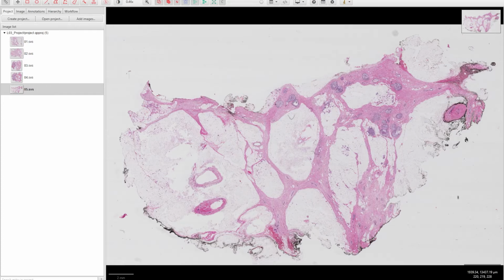This tool is essential for quantifying cell populations, assessing biomarker expression, and supporting diagnostic or research workflows, providing reproducible high-throughput analysis while allowing manual review and correction to ensure precision. So simply, the cell detection tool automatically identifies and segments individual cells in tissues for different quantitative analyses.